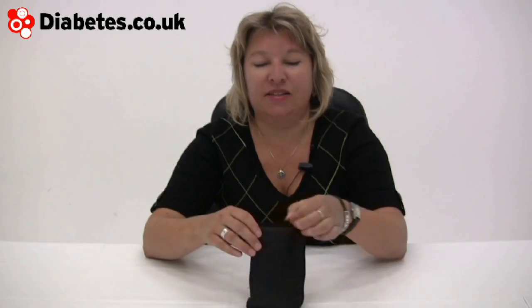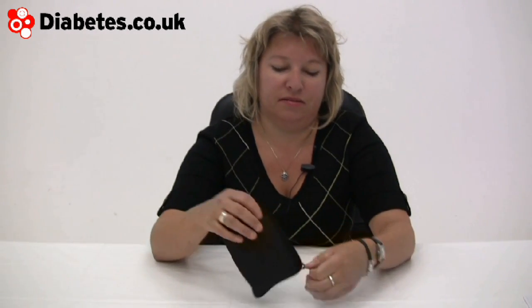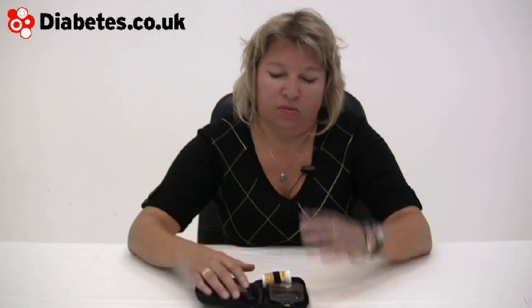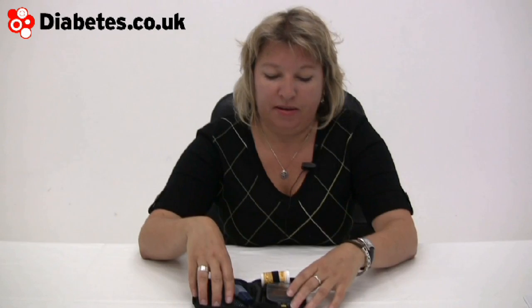This is the Insulinx meter from Abbott, part of its Freestyle range. The name Insulinx links to insulin, and it's actually taking what you might call pump technology, as some of the other meters are these days.